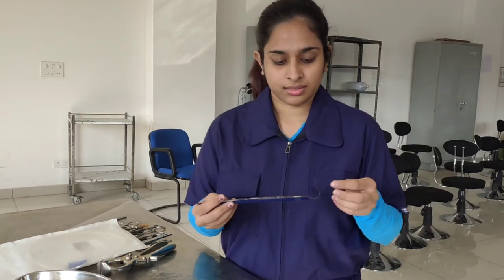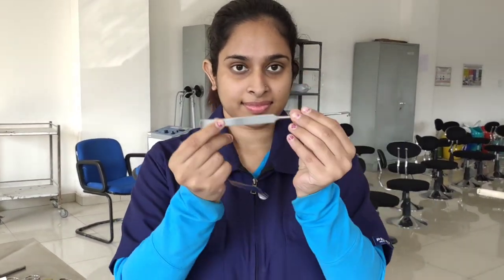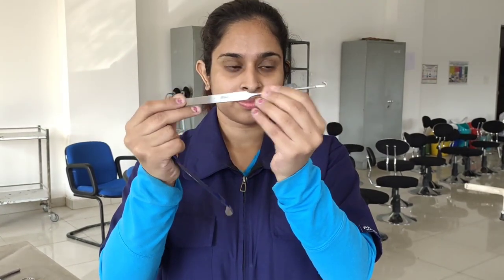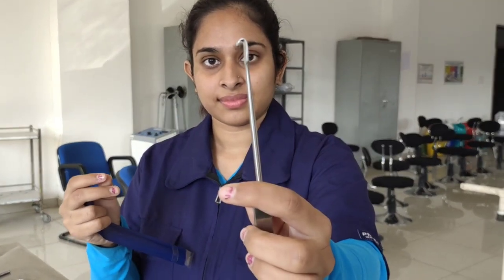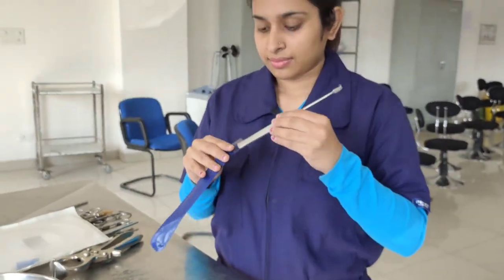Next we have this instrument called the ovarian hook or the spay hook. This surgical instrument is used in ovario-hysterectomy, spaying, or uterine procedures in cats and dogs. The hook provided at this end is used to retrieve the uterine horn while performing the surgery, and hence a minimum incision is required.